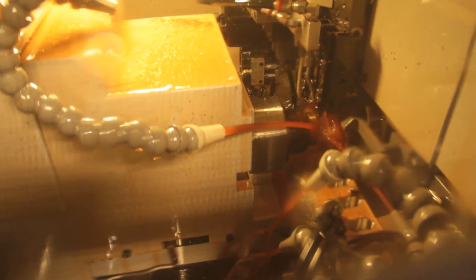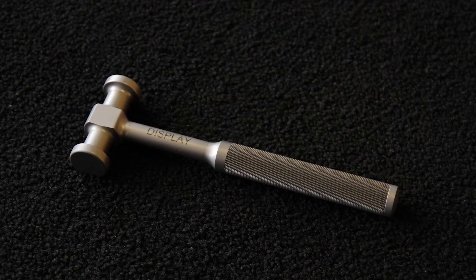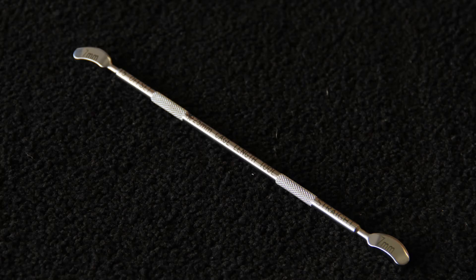We can make parts we couldn't have made a few years ago because of technology changing. We're going from a three- and two-axis machine to now having a nine-axis machine that can be way more complex, way more complicated, and can do a lot more in less time.